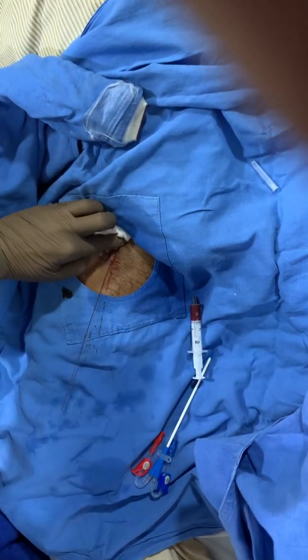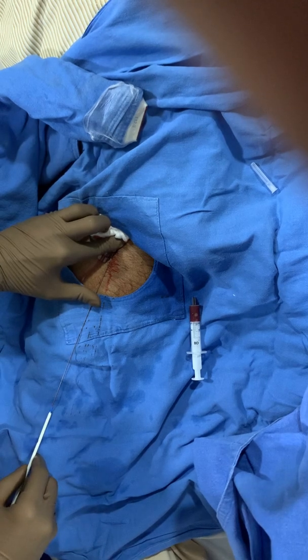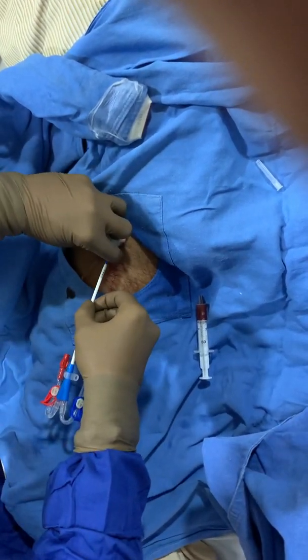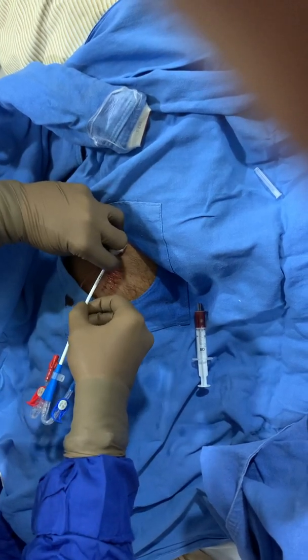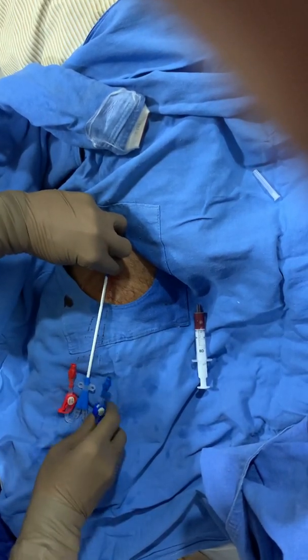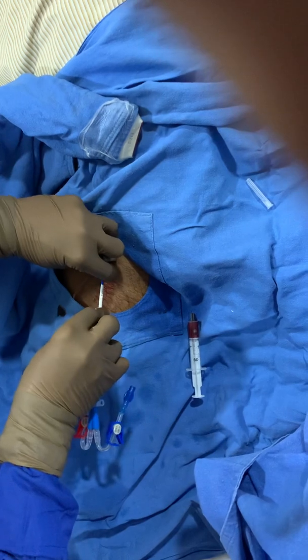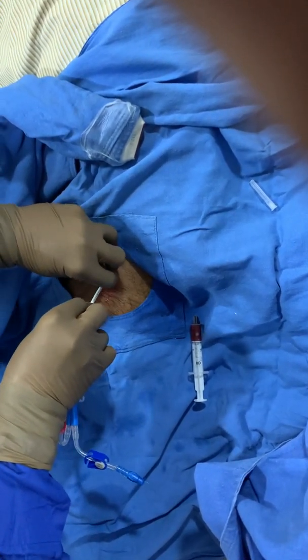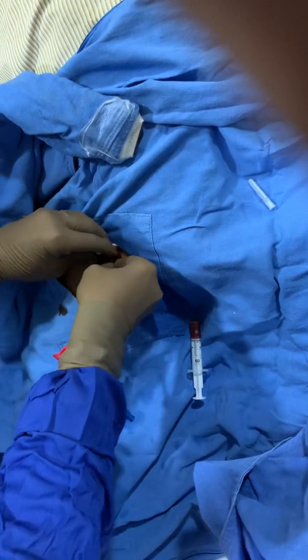And then this is the dialysis catheter — the double lumen dialysis catheter — being inserted. Keeping a close watch, once the guide wire comes out, as we can see it's coming out and it's out. Straight away in.